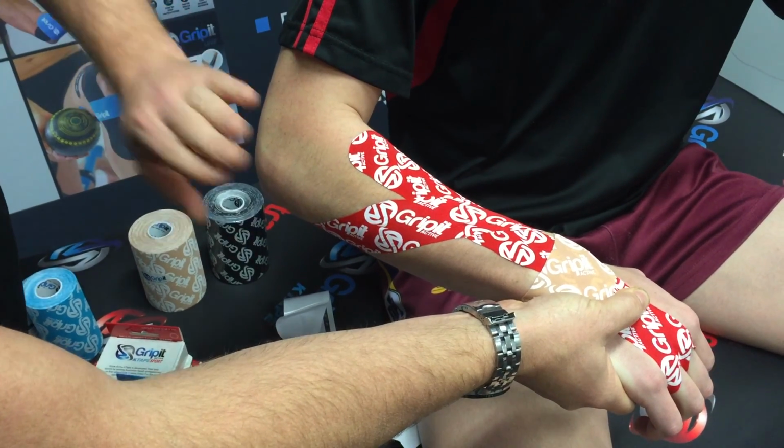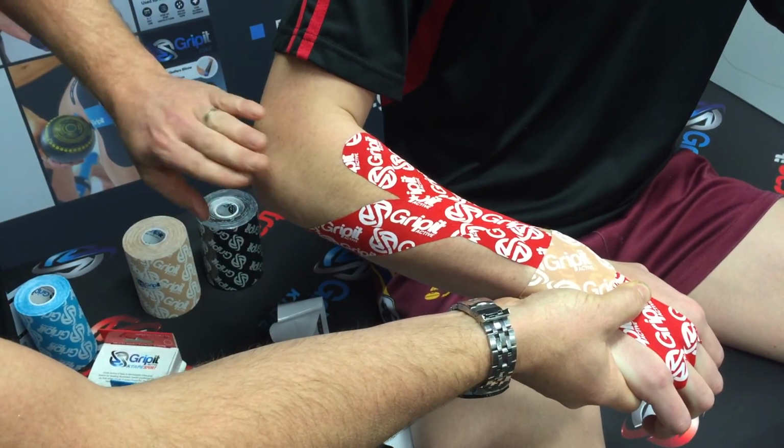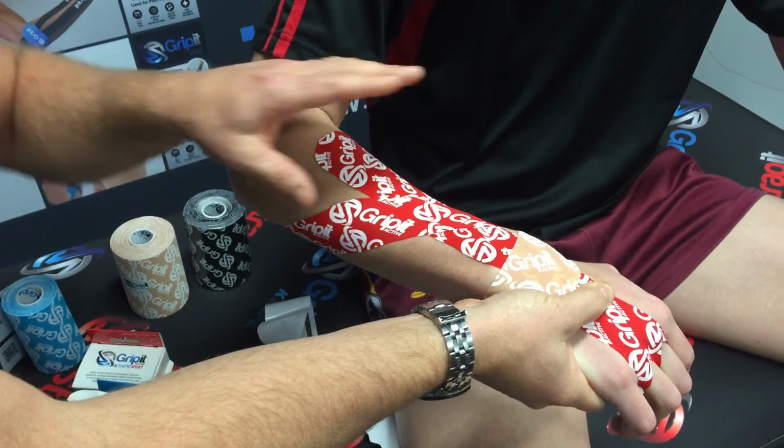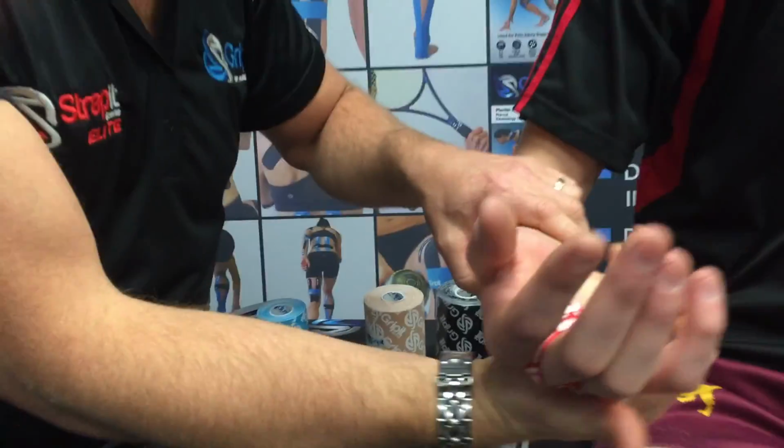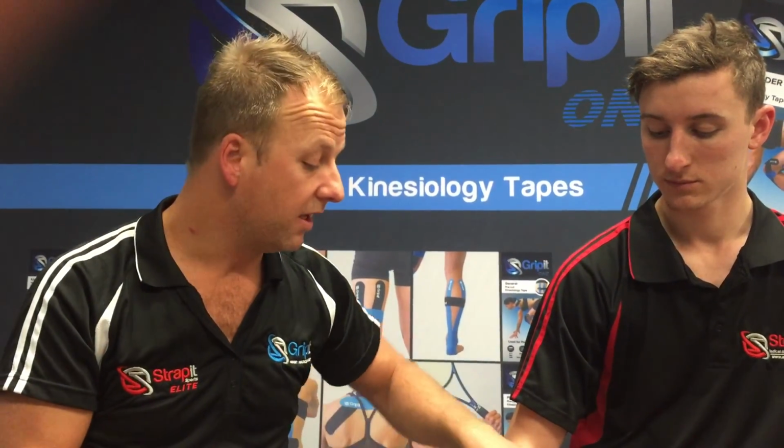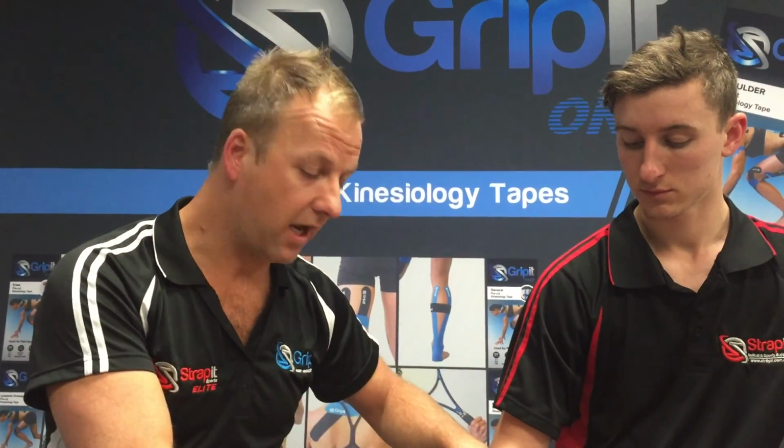So lack of involvement of these muscles, which means lack of stress of the tendon, which means that your tendinosis or tendonitis has a chance to have a break. So you still do your exercises to relieve this problem, but it's very good for people who are still playing or who are still working. So, because we talk about tendons do like some form of load, but that's controlled load. Erratic load like at work and at footy or tennis or basketball isn't good load. And so this is your chance to unload it.